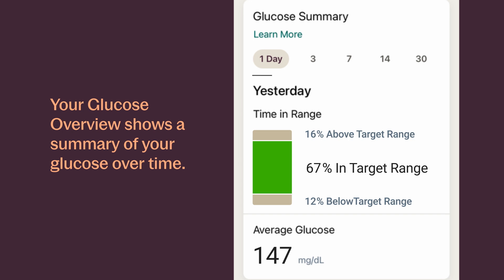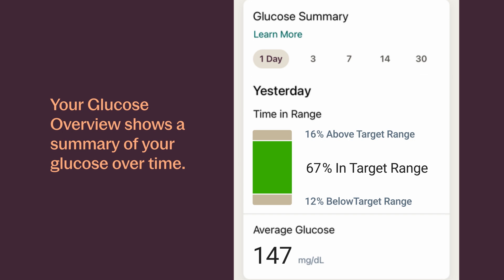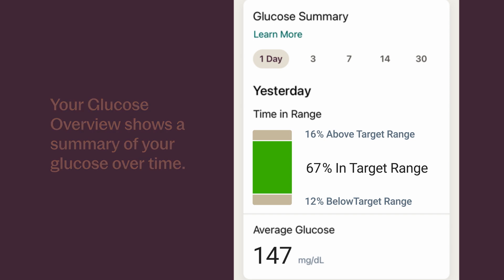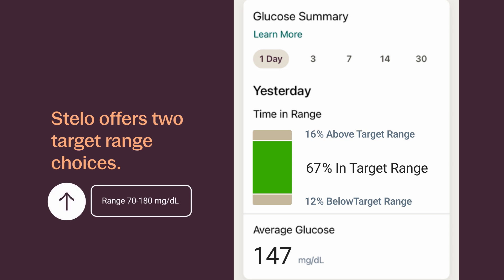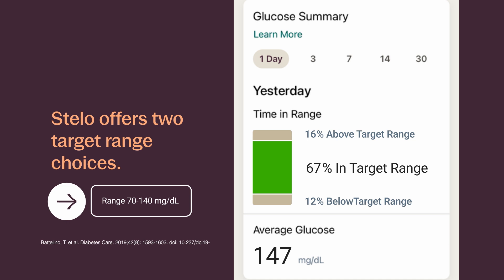You can choose between 1, 3, 7, 14, or 30 days. This report displays some key information. One is your time in range — the percentage of time your glucose levels were in low, target, and high ranges. Stelo offers two target range choices: 70 to 180, which is the international consensus for people with diabetes, and 70 to 140, which is for people without diabetes, including those with pre-diabetes.